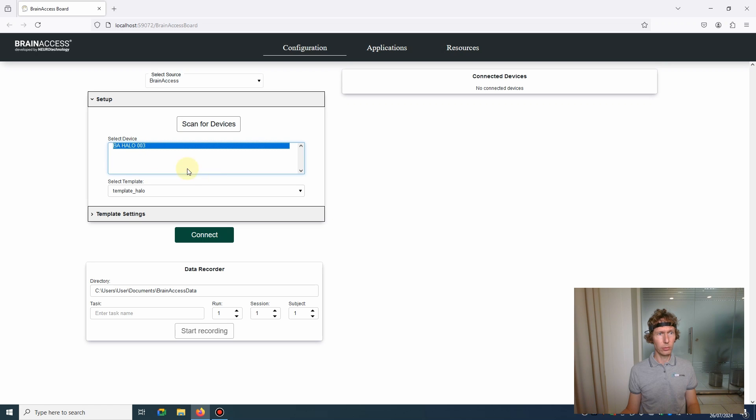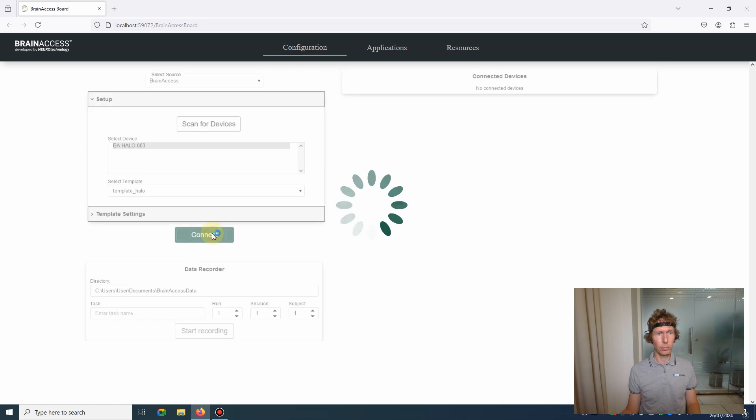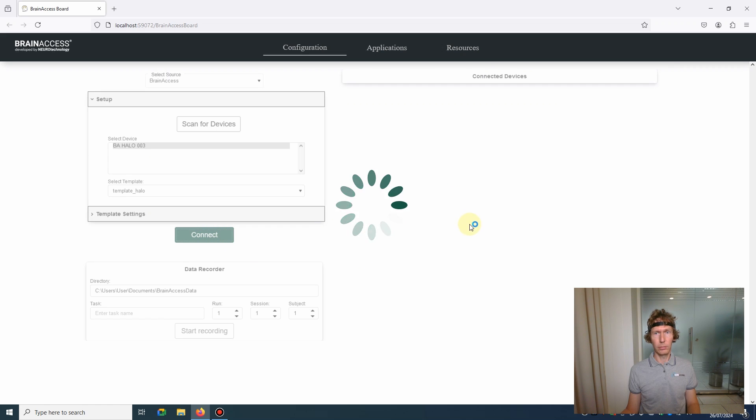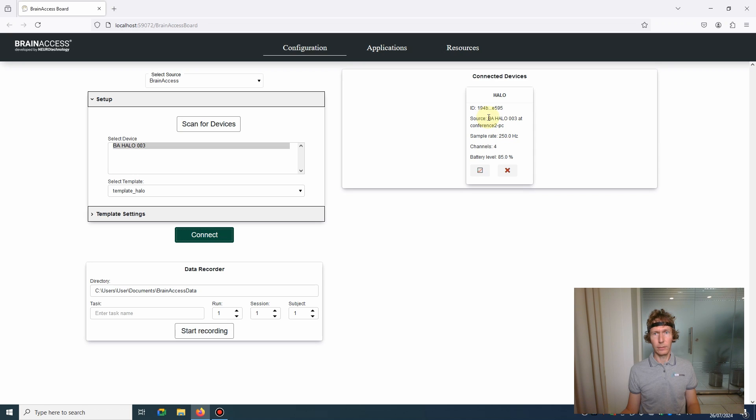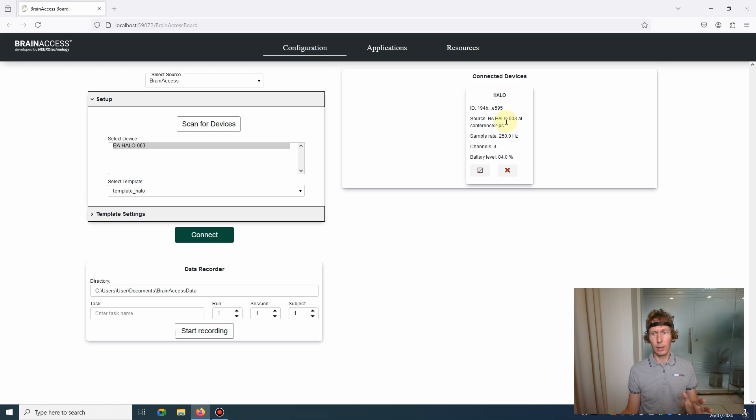That's the Brain Access Halo. Select it, press connect, and after some time the Brain Access Halo device tab will appear here and contains some useful information. It contains the stream name as well, which you can find on the lab streaming layer, and some other information like sampling rate, channels, and the remaining battery level.